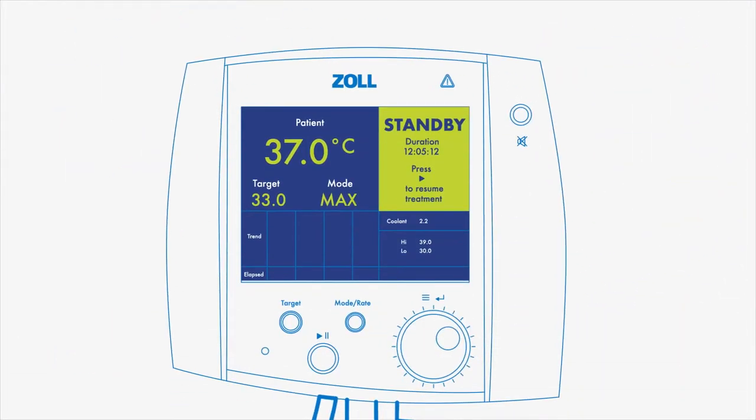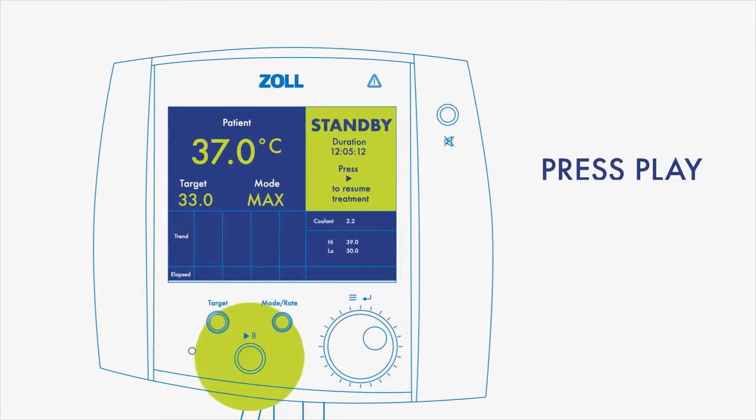Double-check the target temperature and mode. The system is now on standby. To take it out of standby, press the play button.